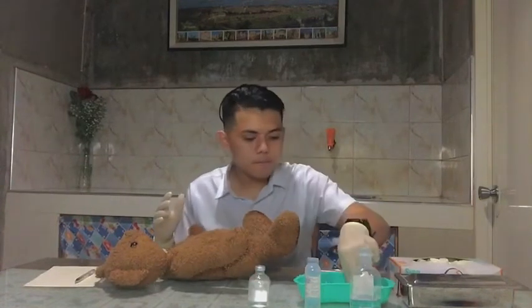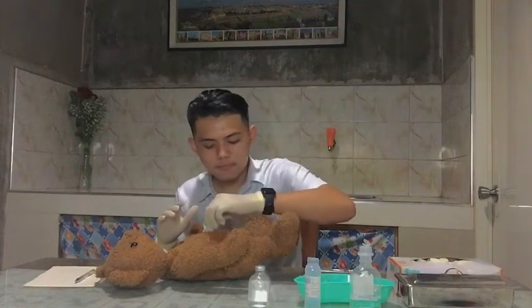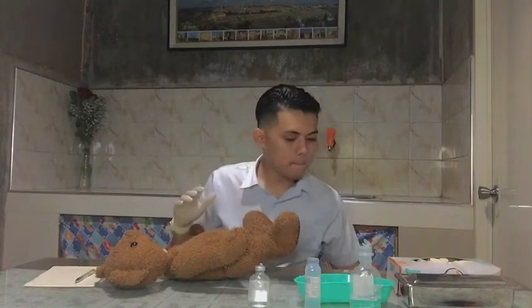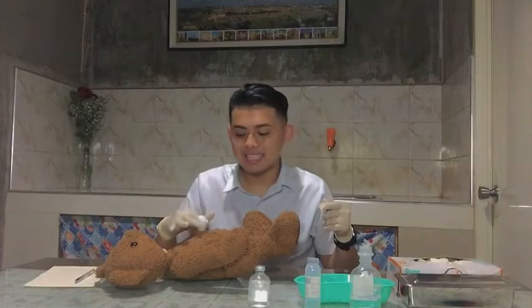Dry, wet, then dry. Place this one here. And position the swab on the client's skin above the intended site. I will do this because friction aids in cleaning the skin and removing dirt in an outward direction. Now we will be preparing the syringe for injection and remove the needle cap while waiting for the antiseptic to dry.